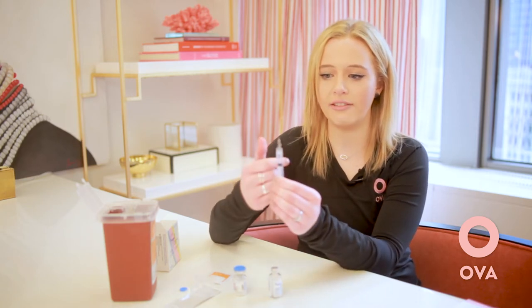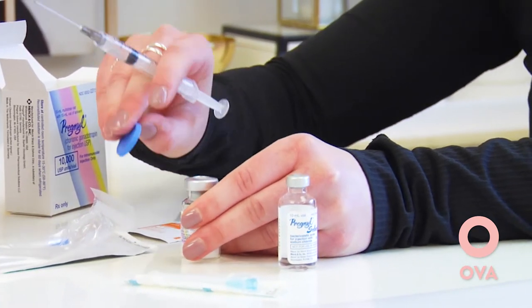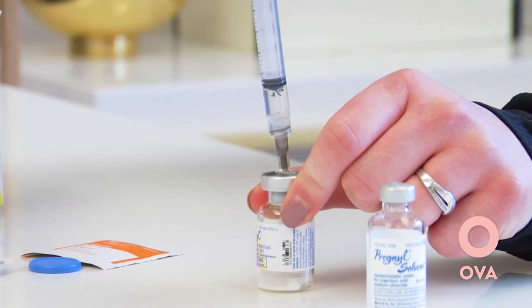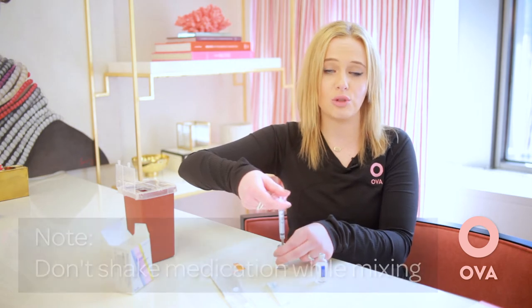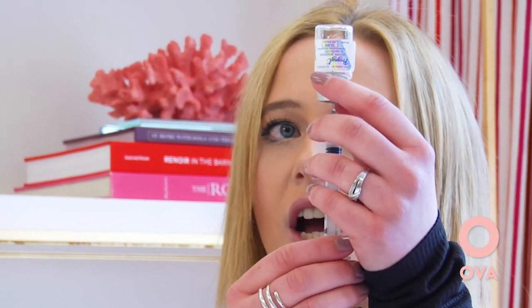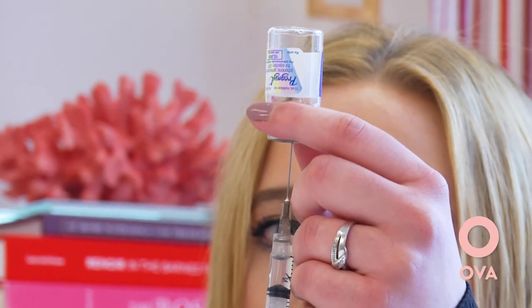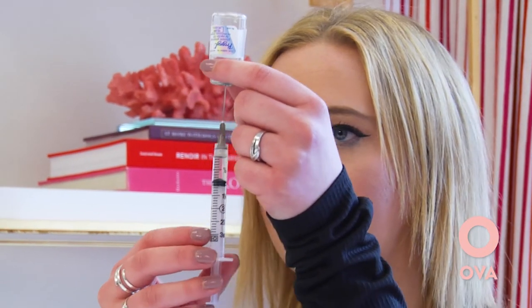If you have any air bubbles, go ahead and give it a little flick. Then pop off the cap to the powder — the medication itself. Now we are going to mix the water with the powder. Puncture the vial of medication and inject the entire cc or milliliter. It should dissolve automatically, but if it doesn't, just give it a little twist. Make sure you don't shake it because shaking will create air bubbles and make it harder to draw. Then flip it over and withdraw the needle so that it's under the fluid. Once it's under the fluid, pull back — retracting the needle — so you're able to draw out all the liquid. You put one cc of fluid in, so you'll be getting one cc back out.